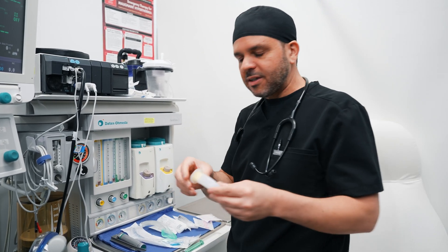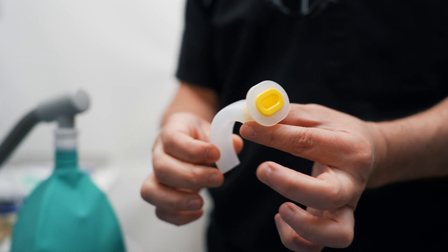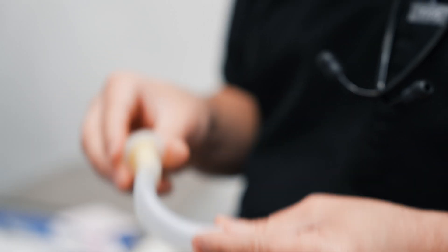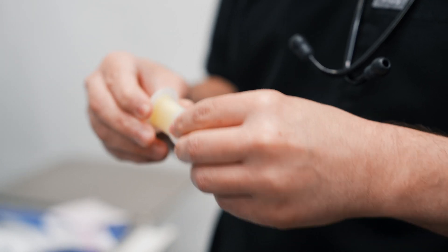Another device used sometimes is an oropharyngeal airway. This also serves as a bite block, because a lot of times when patients are about to wake up, they actually bite. So this goes in their mouth and they'll bite this, but not the tube itself.